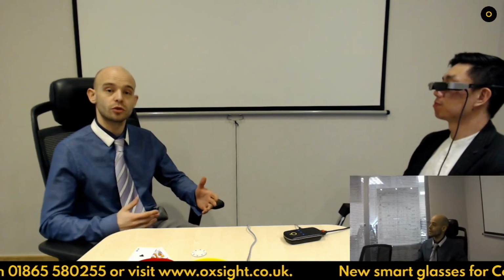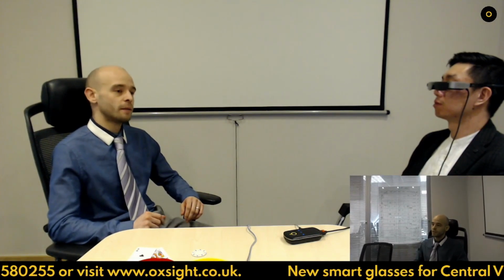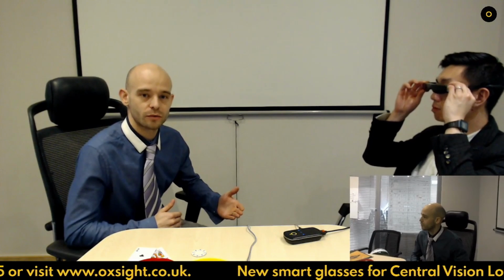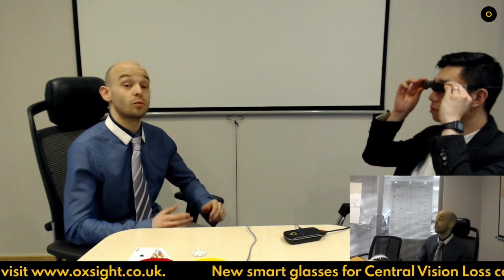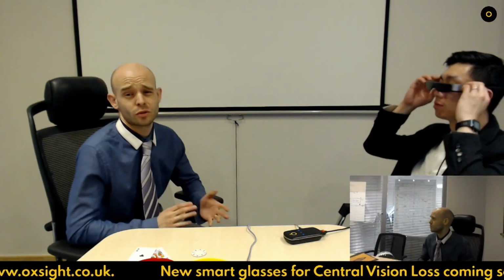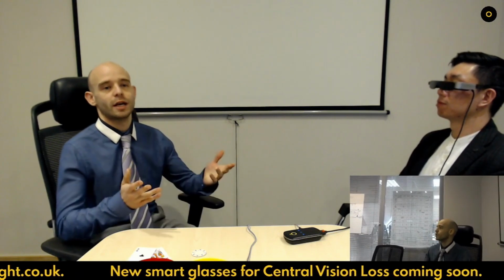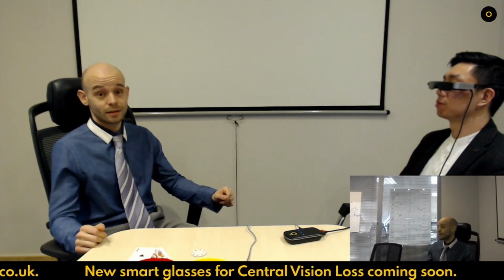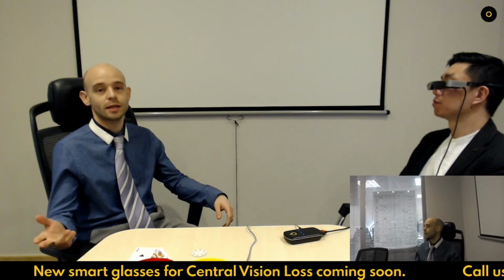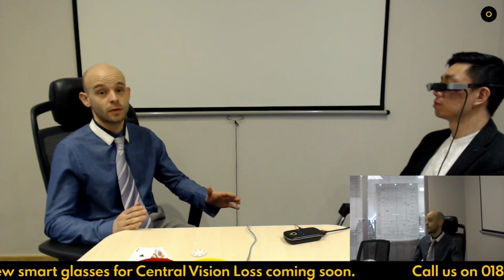You won't lose as much of that social connection when you're being asked a question, or if somebody is turning their head and asking someone else a question, you won't be answering their question for them. So this is one of the things it's really good for. Normal mode is also really good for things like if you want to watch cinema, or you want to go and watch TV, or you want to go to a social occasion. For instance, I was talking about weddings, birthdays, kids' presentations, when you're going to see the kids play, normal mode will do most of that. It's really good for that kind of thing.